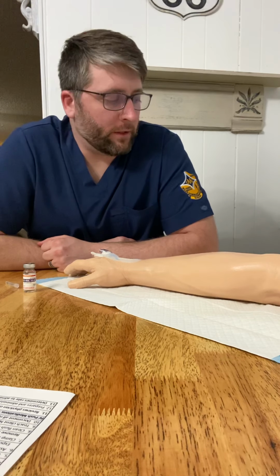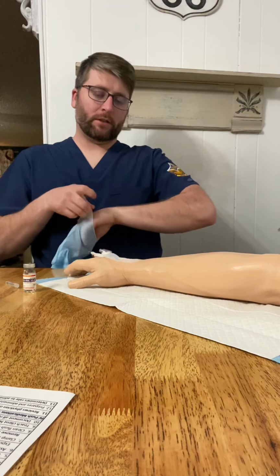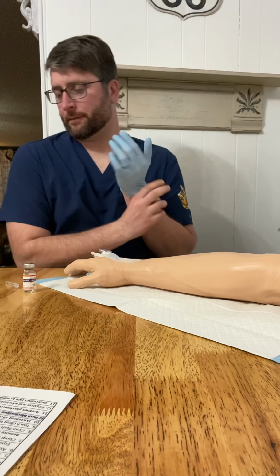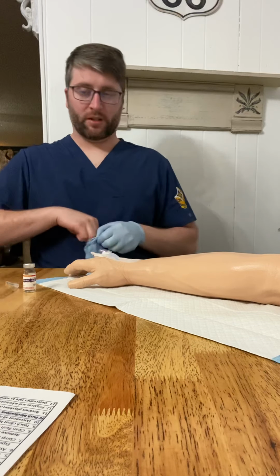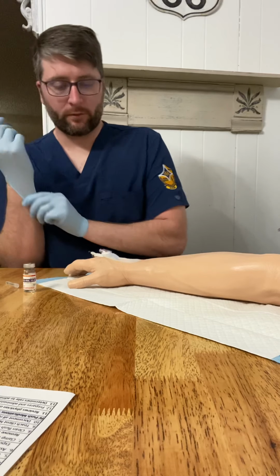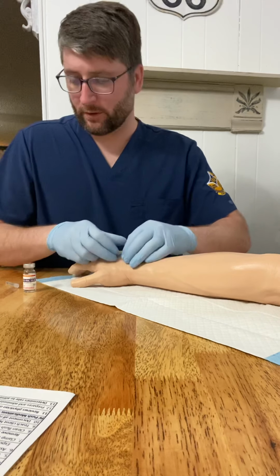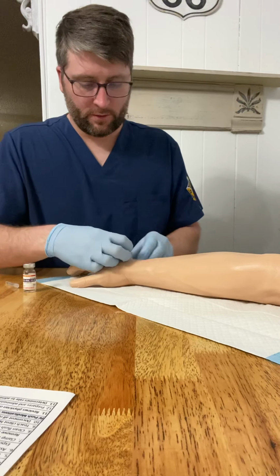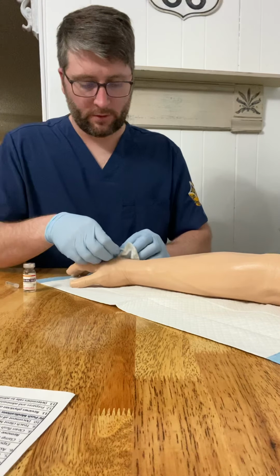We are coming back, and we do have an order to discontinue our IV. So this time we're going to put on clean gloves, and we're going to tell the patient, hey, we're going to discontinue this IV. You're getting ready to leave, or we're going to change sites, or something of that accord. So put on clean gloves, and then we're going to loosen from around the site, all around the IV with the tape. There we are.